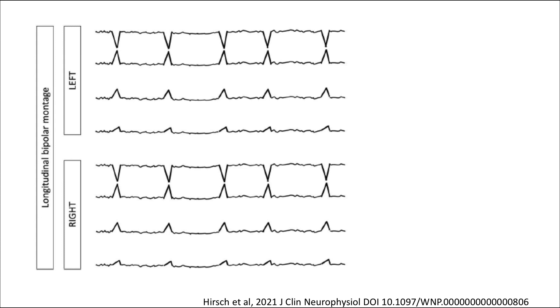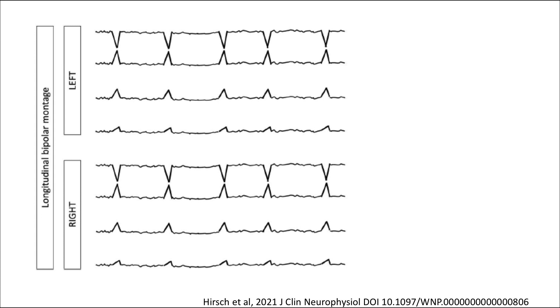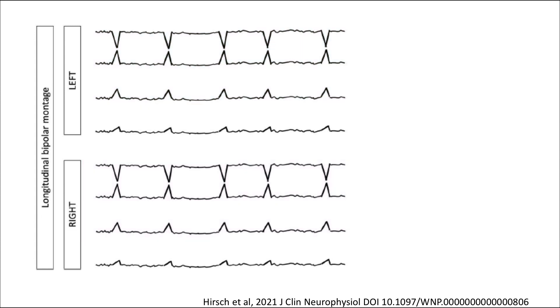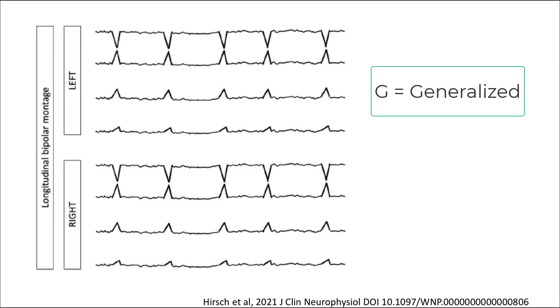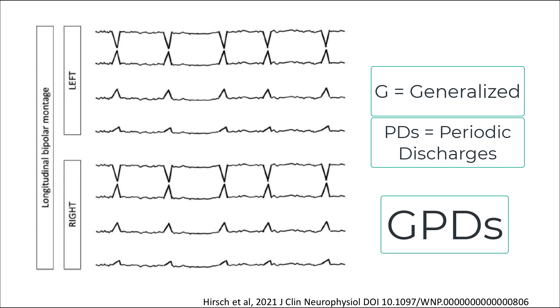Here is an example of generalized periodic discharges. These waveforms are of similar amplitude and morphology on both the left and right hemispheres, which is why we define this as generalized. We use the first term G or generalized, and the second term PDs or periodic discharges because of the clear inter-discharge interval, giving us generalized periodic discharges.